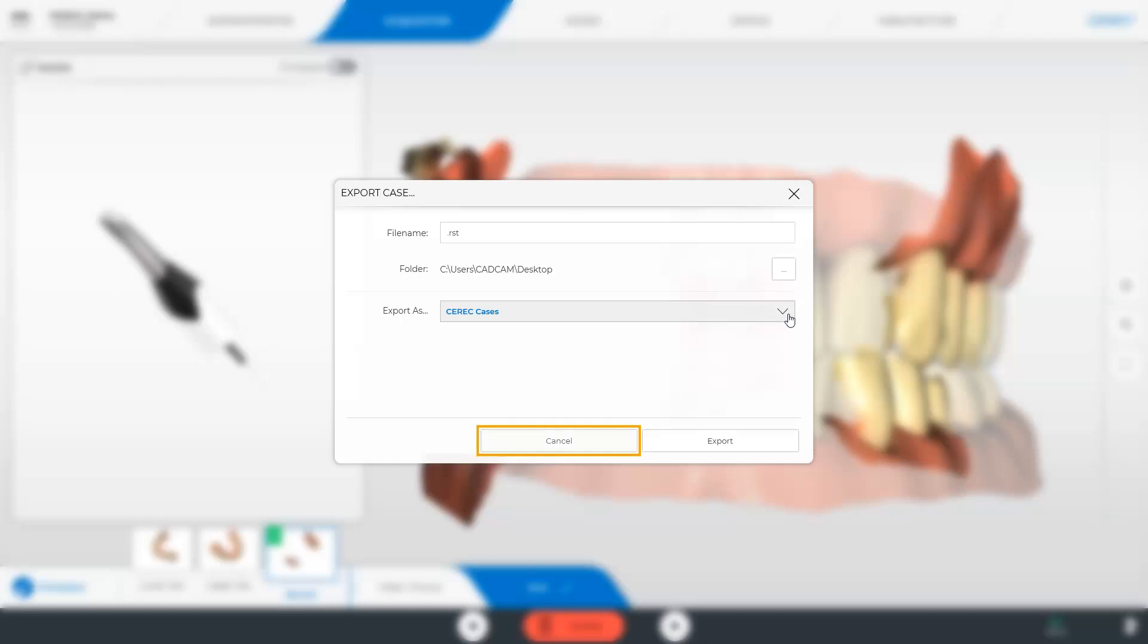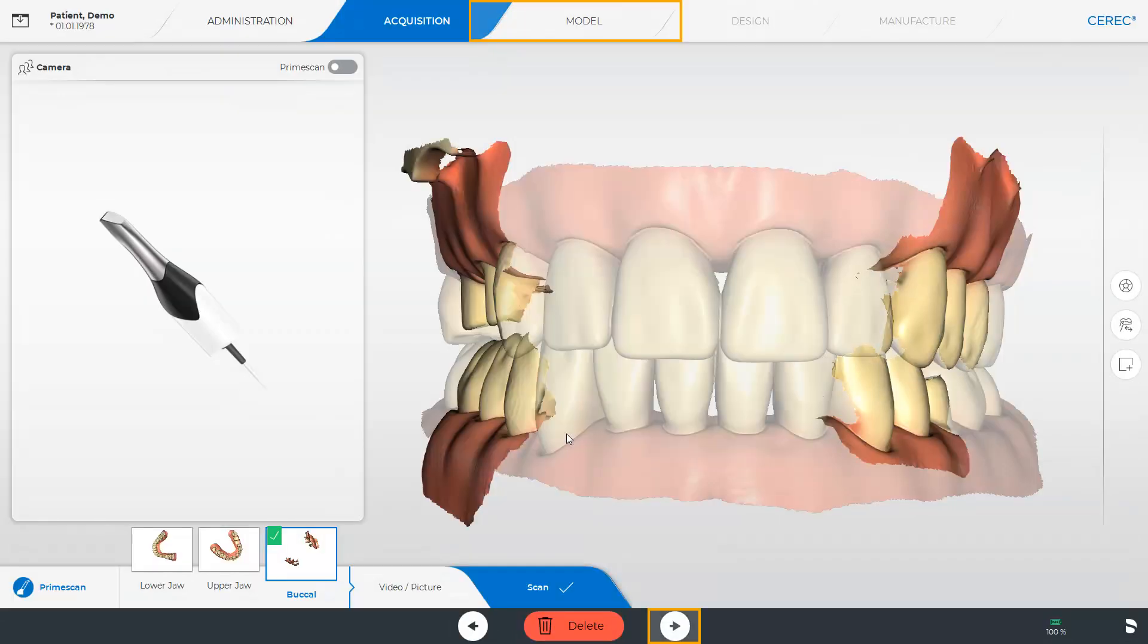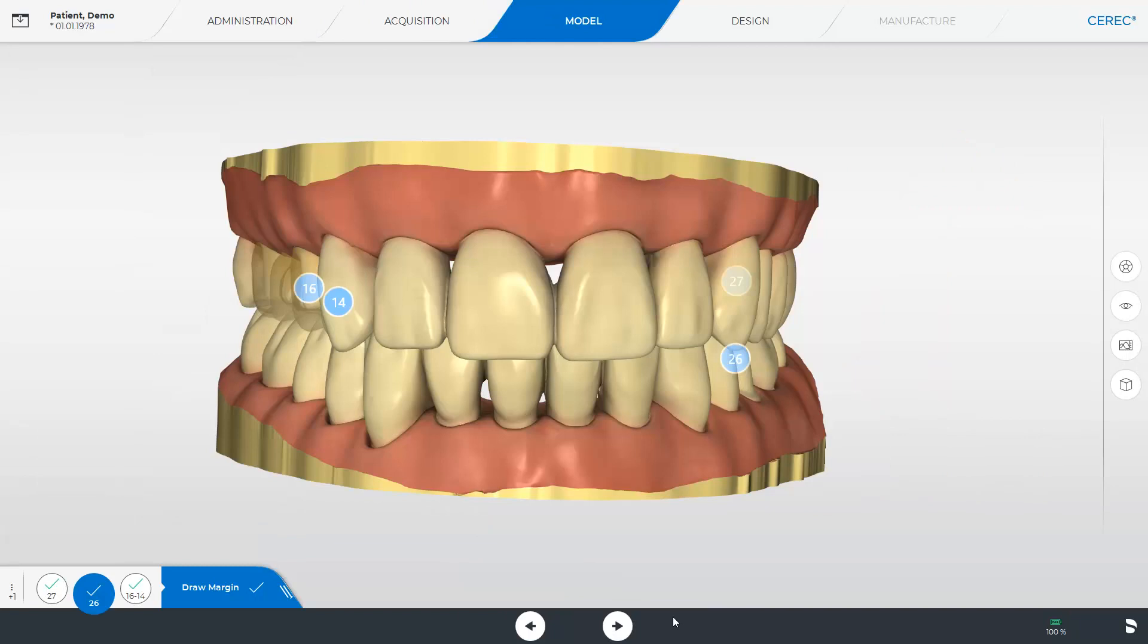We cancel the process and switch to the next phase, the model phase. Now that the model data have been calculated additional export options are available. For this purpose we open the system menu once again.